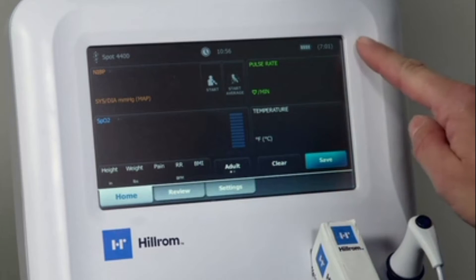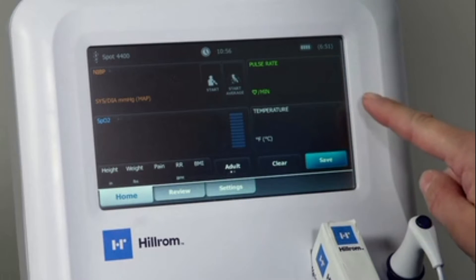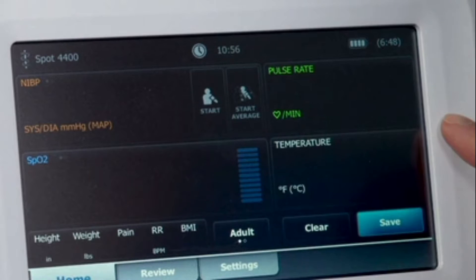In the status area at the top, you will see the device name, current time, and battery charge level. Below the status bar, you will see the main active area, where you can start an exam, document additional patient data, change the patient type, and save or clear a reading.